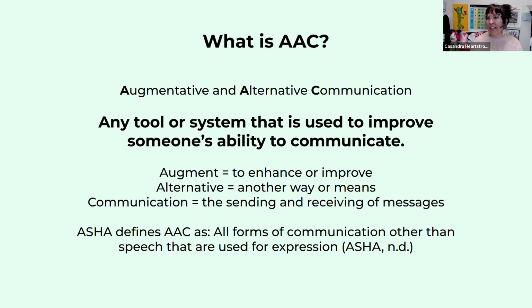In this case, it would be an augmentative tool versus alternative, having a different way to communicate for our students who maybe have cerebral palsy and don't have access to their speaking mechanism, and they need a totally different way of communicating.